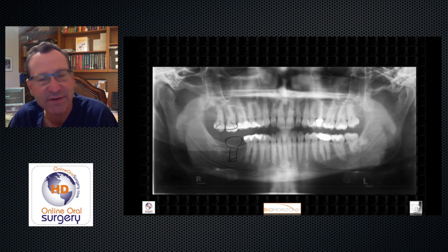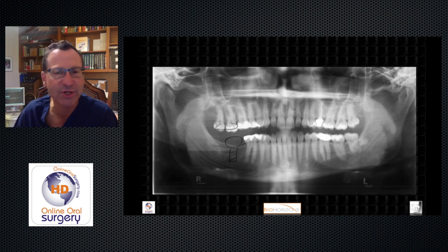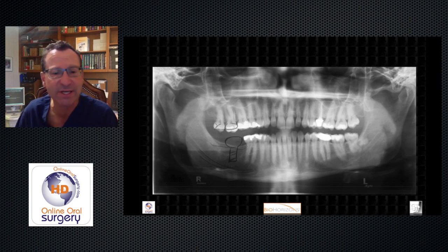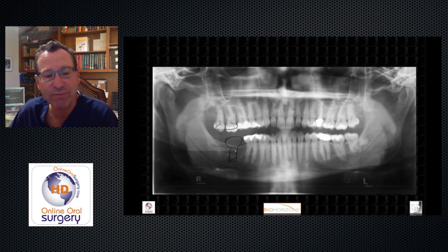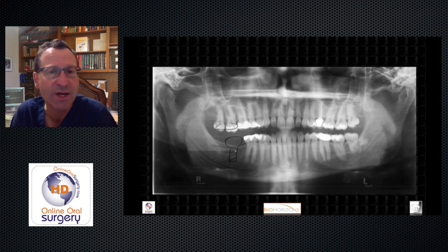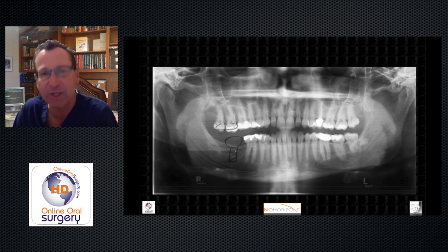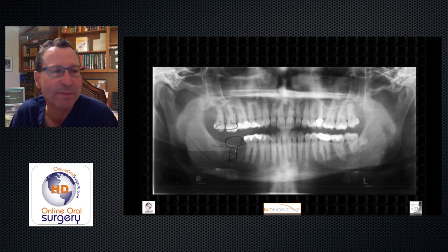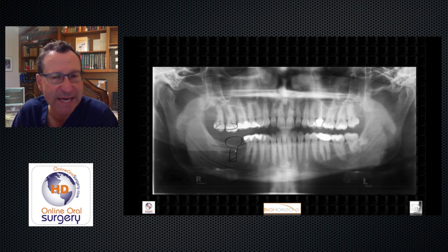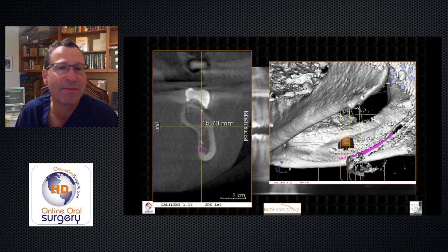This is a patient I saw right before I started doing CT imaging and guided implant surgery — before I had cone beam in my office. I took out tooth number 31, did ridge preservation grafting, and the site was ready for an implant. I marked out the dimensions of the crown, the dimensions of the implant, and the location of the mandibular nerve. It looked like there was plenty of room for at least a 13-millimeter implant.